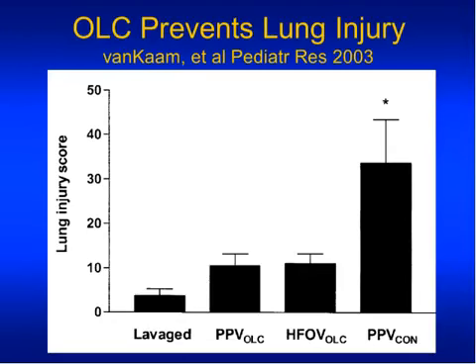So the bottom line in terms of strategies for prevention of lung injury, we talked about most but not all of them. Optimal delivery room stabilization is certainly important. Avoidance of mechanical ventilation seems to be more important perhaps than other things next to this. But once we do have to ventilate, avoiding excessively large tidal volume is critical, both in terms of lung injury and brain injury. Optimizing lung volume is critical in making the other strategies work. So atelectatic lungs are bad. If you ventilate them, we're going to get into trouble.